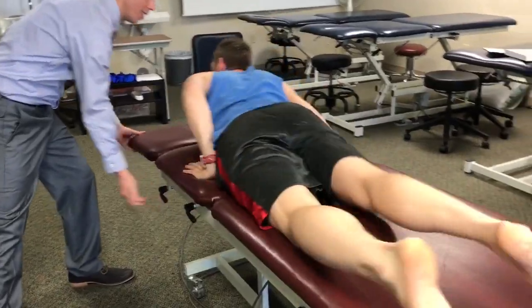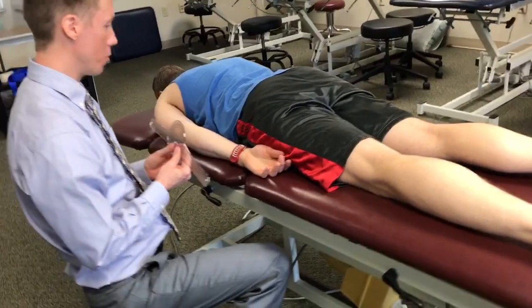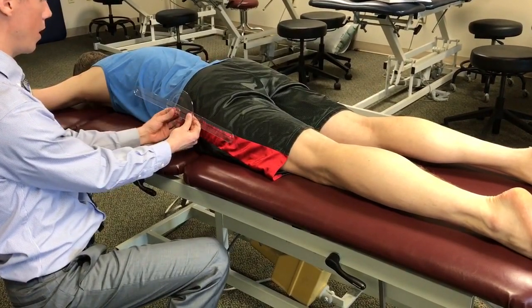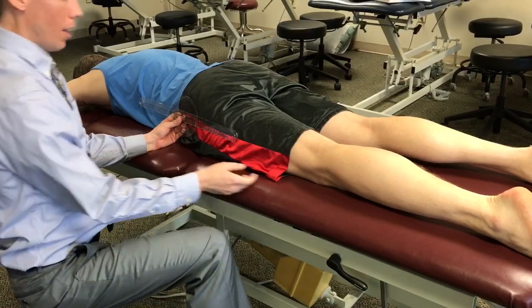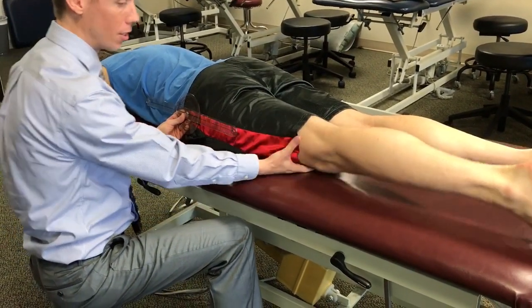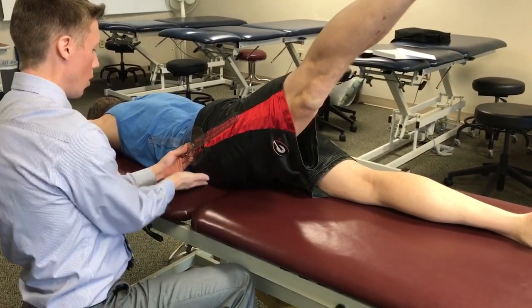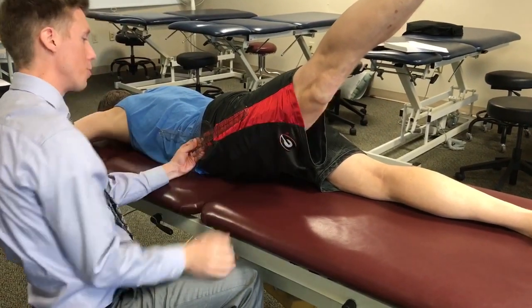Next we can ask him to move into prone. For hip extension we use the same landmarks we used for hip flexion: greater trochanter as our fulcrum, midline of the trunk as our stationary arm, and lateral epicondyle of the femur for our movable arm. This should be done with the knee straight to limit the effect of the rectus femoris, and usually this is an active assisted motion because the leg is very heavy. He goes into full extension and we make sure his ASIS remains on the plinth, then take the measurement there.